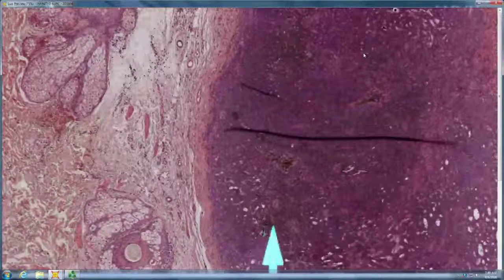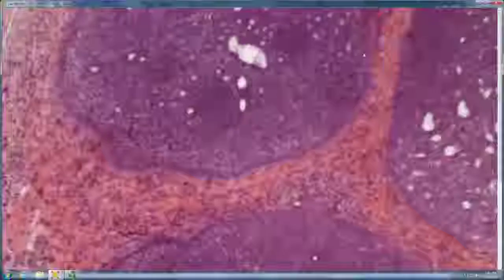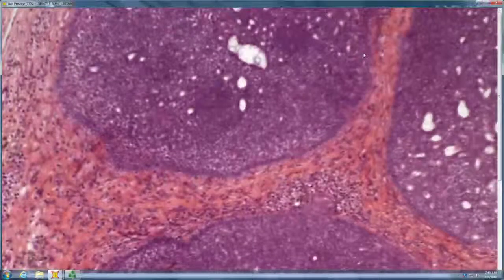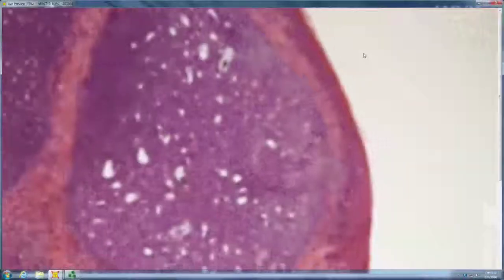The other thing is this one is pigmented, and it would be rare for a sebaceous tumor to pigment. But it certainly palisades. You have a concentric fibroblast-rich stroma. It's made of basaloid cells. So a big ball of basaloid cells, concentric fibroblast-rich stroma. Trichoepithelioma.